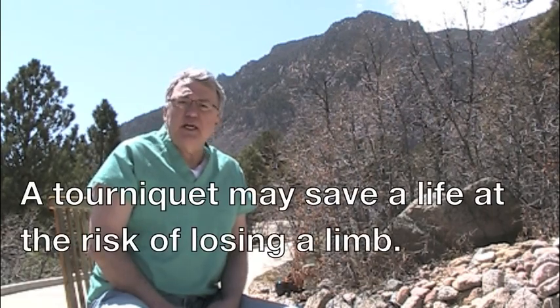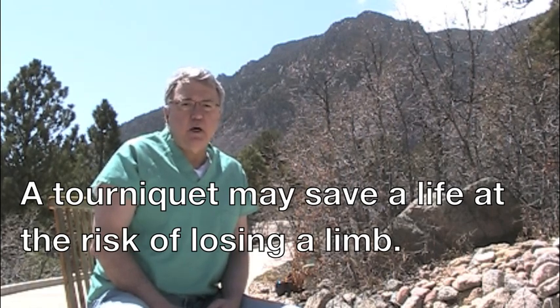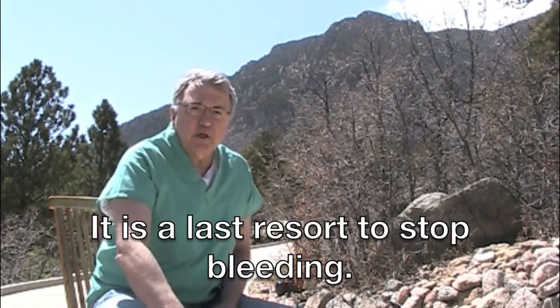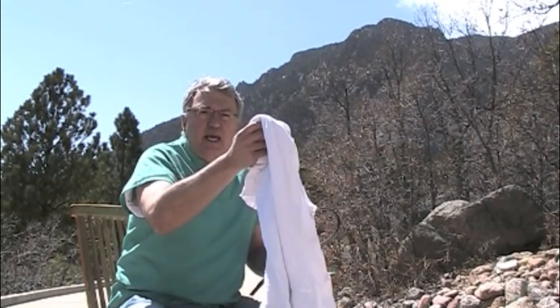Today I'm going to talk about tourniquets. A tourniquet can save your life in certain situations. You can also lose a limb easily if you use a tourniquet, but sometimes that might be the risk you have to take. If you have a commercial tourniquet, then great. Maybe you already know how to use it, but I'm going to show you how to use a tourniquet with about anything you have, such as a belt, a sock and a stick, or just a shirt and a stick.